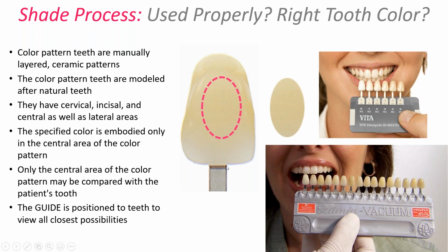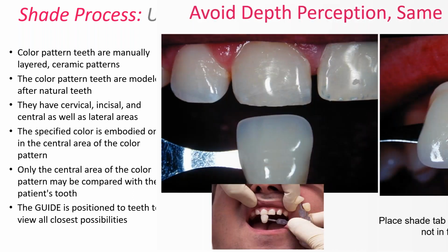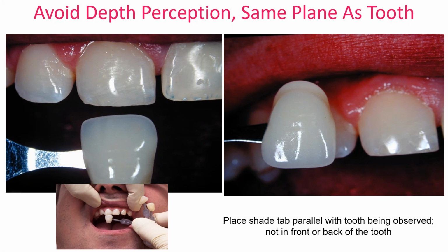We often look at the incisal third for translucency communication. And that's where we go to get the C range, usually. The tooth looks grayer. There's a little bit more translucency. It's grayer, so therefore I'm going to select maybe a C shade because it's got that grayness. It's got a brightness to it, but it's got grayness as well. And that's where we start to intermatch between different shades and so forth.